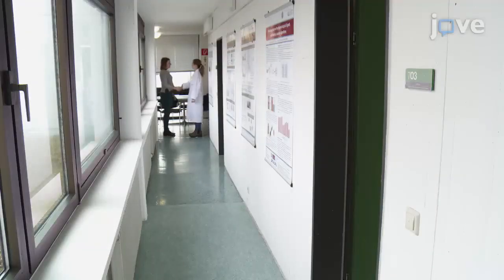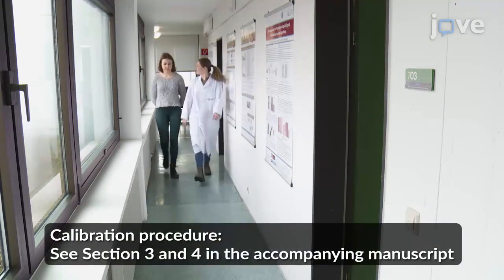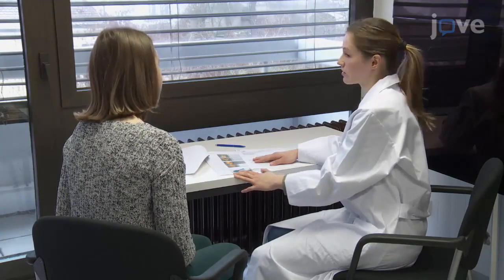To prepare for the procedure, welcome the arriving subject and lead her to the calibration room. Inform her in detail about the calibration procedure in the following pain stimulation.